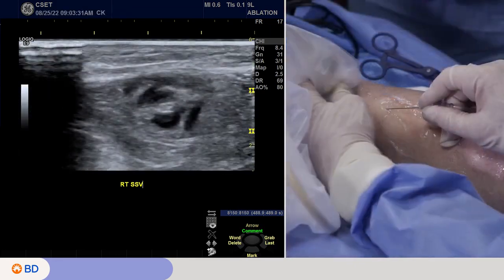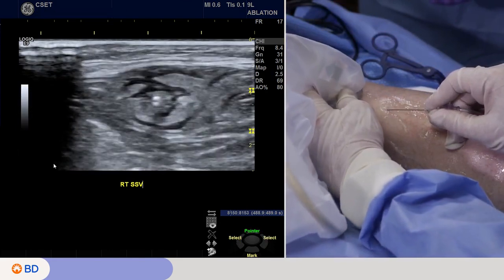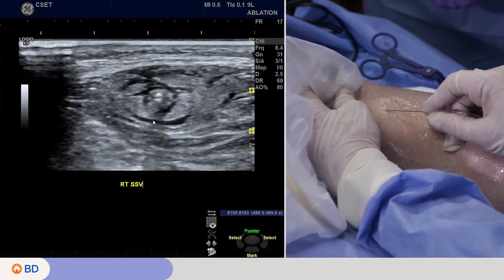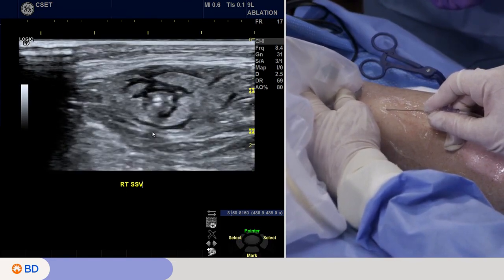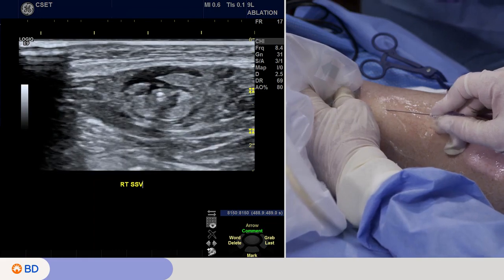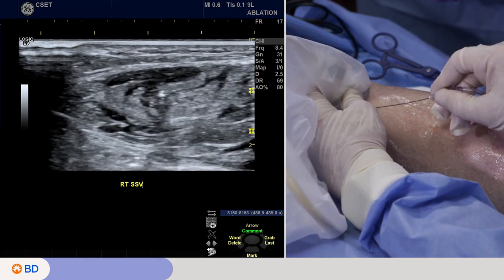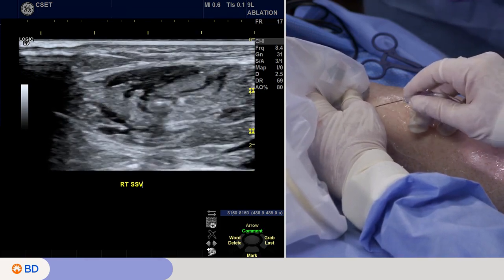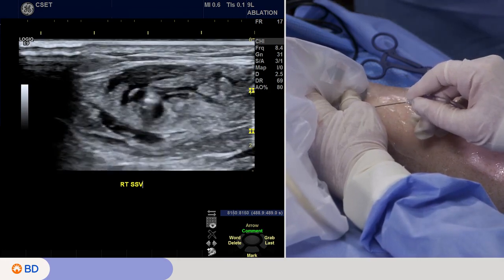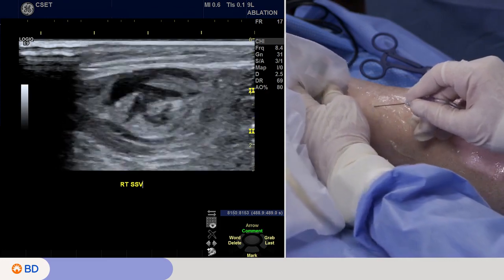That's the tip. And we are at the tip. And you can see that nice shadowing. You know the tip because you see these 3 acoustic shadows, and that's really telltale to know that that's the coil. Again, this imaging is very good, but other patients might have a lot of fibrosis, and it's very easy to be fooled. And it's really vital that you know exactly where your catheter tip is when you're administering the heat.